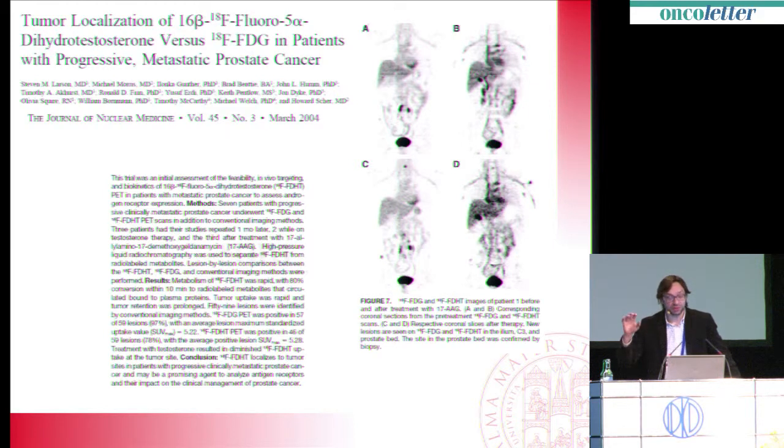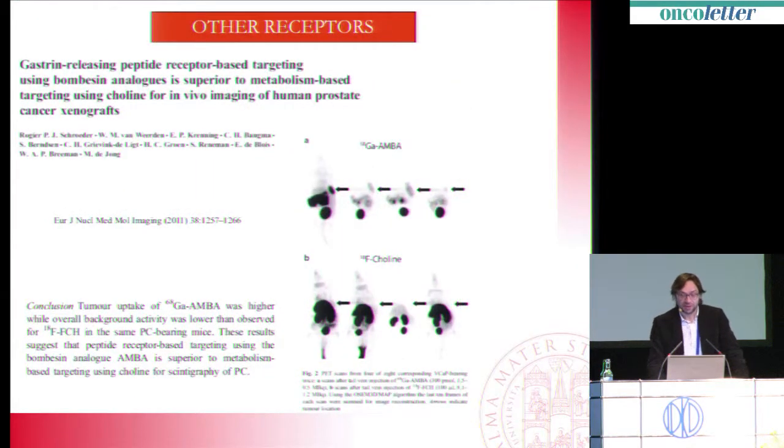And I guess the main problem is the fact that in any case, you will treat the patient with hormonal therapy, and you will get the information clinically. So most likely, that same information can simply be obtained by clinical evaluation of the patient under hormonal therapy. And indeed, there has been a reduction of the interest in this tracer that, in my view, cannot be considered as pretty new right now.